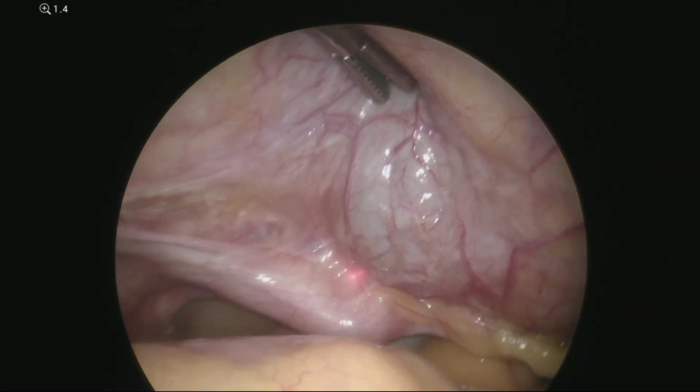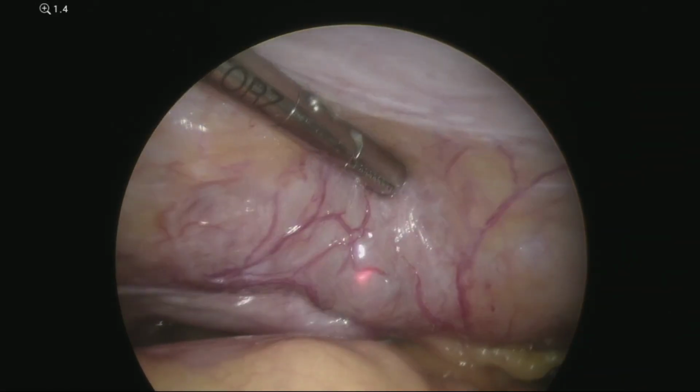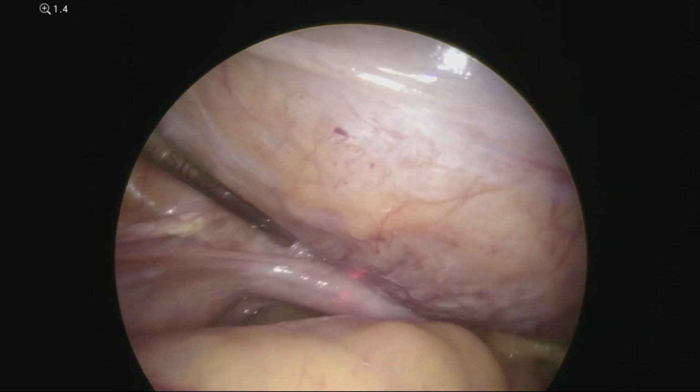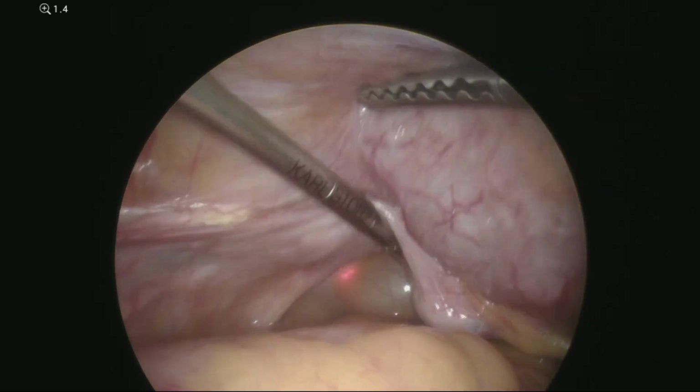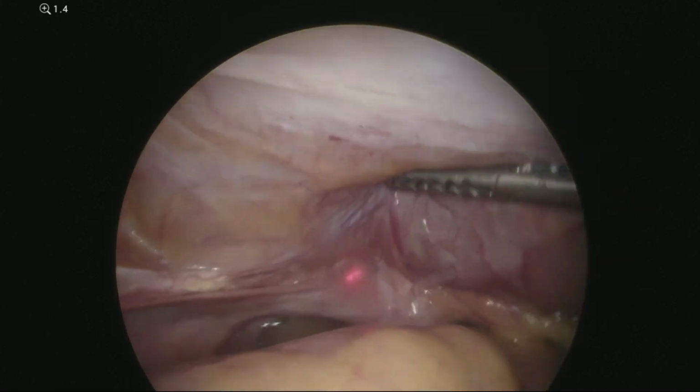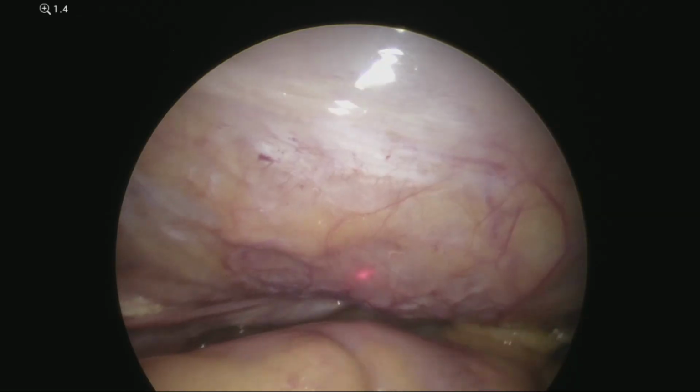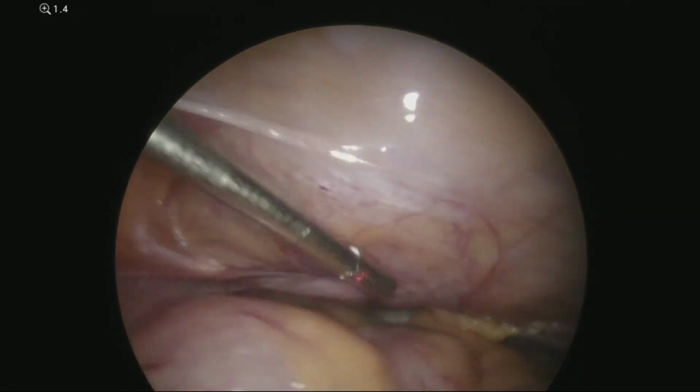Given the proximity between the bladder and the mass, methylene blue was instilled into the bladder to ascertain its location. Upon instillation of methylene blue, the mass was no longer recognizable transperitoneally, suggesting that the bladder was juxtaposed anteriorly to the mass as suggested by MRI findings.